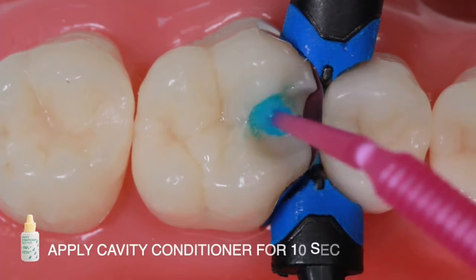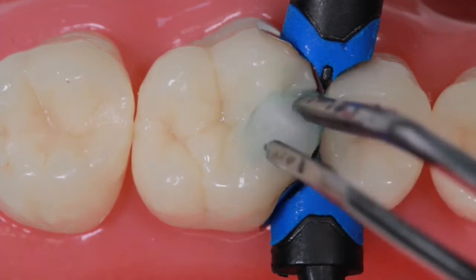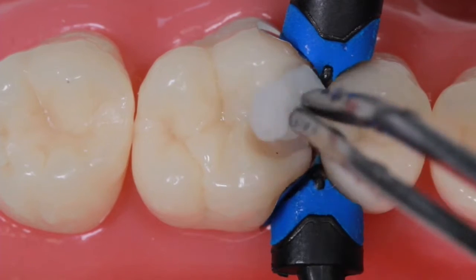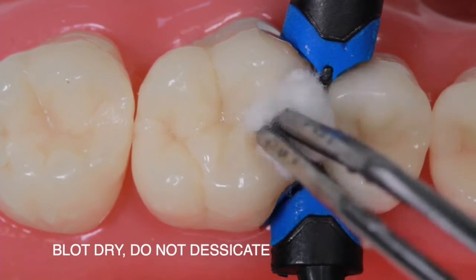Apply cavity conditioner and leave for 10 seconds. Rinse thoroughly with water. Blot dry, do not desiccate.